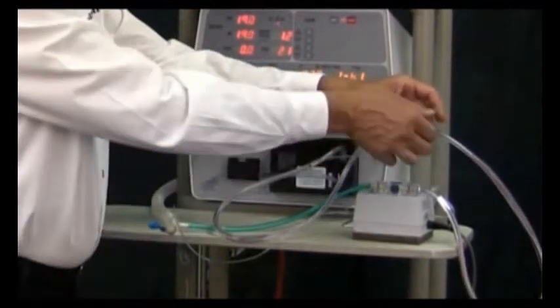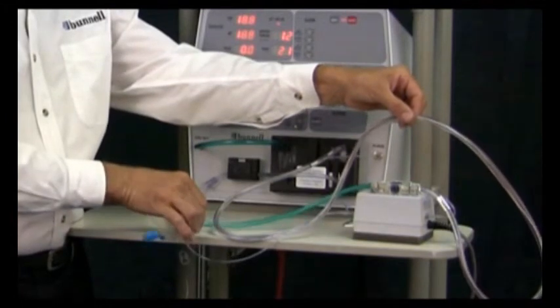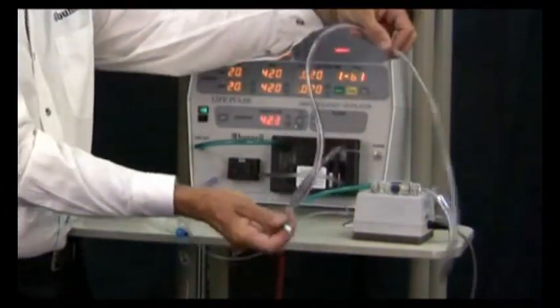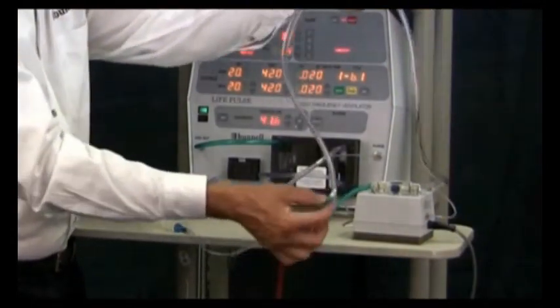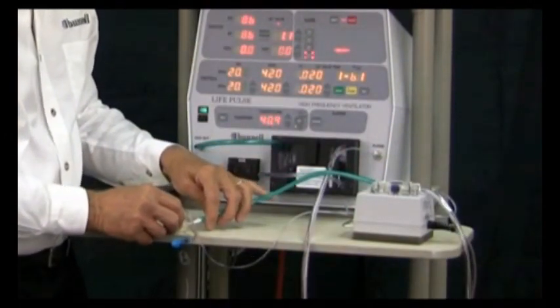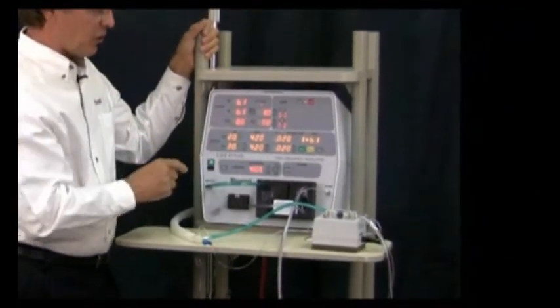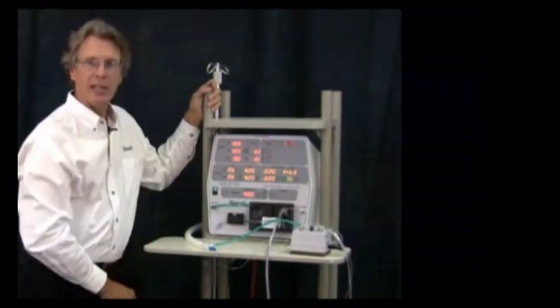With the help of an assistant, or if you're ambidextrous, you can then disconnect the jet circuit from your patient's endotracheal tube adapter. Once it's disconnected, you can direct it toward a towel or a diaper, and then you can lift that last piece of circuit up and give it a little shake. The water will jet out of the end of the circuit. You'll see the loss of PIP alarm comes on. That's what you want. Then you can reconnect to your patient. As soon as you do, the loss of PIP alarm goes away. The servo pressure alarms and mean airway pressure alarms will also go away, and the audible alarm can be silenced by hitting the silence button.